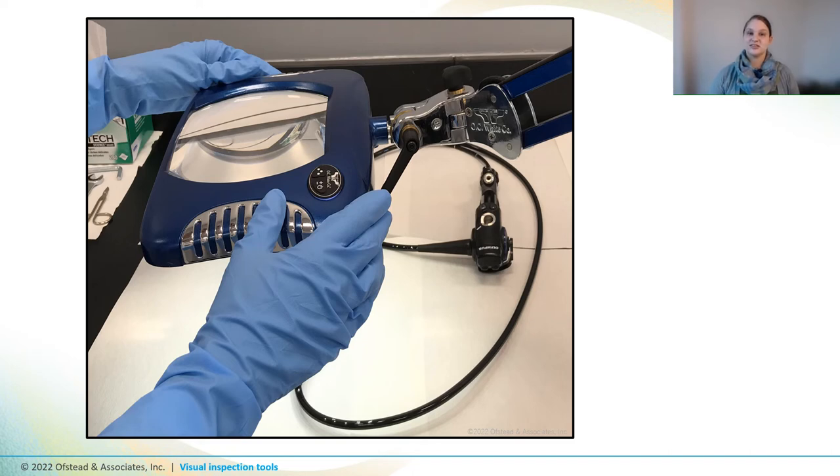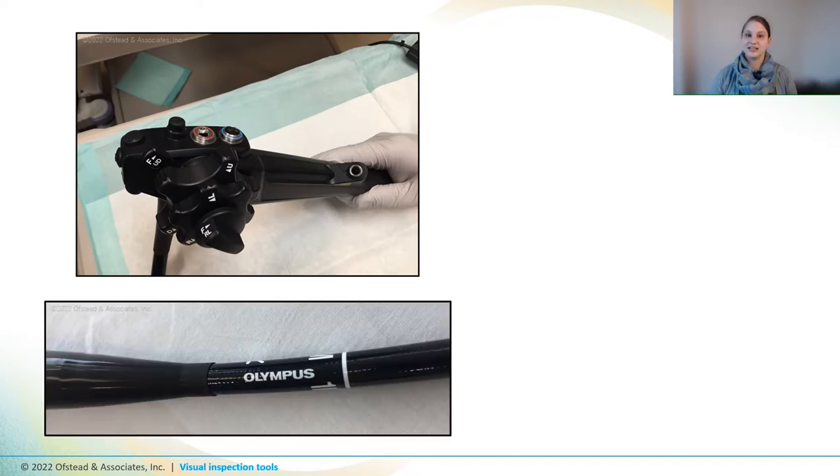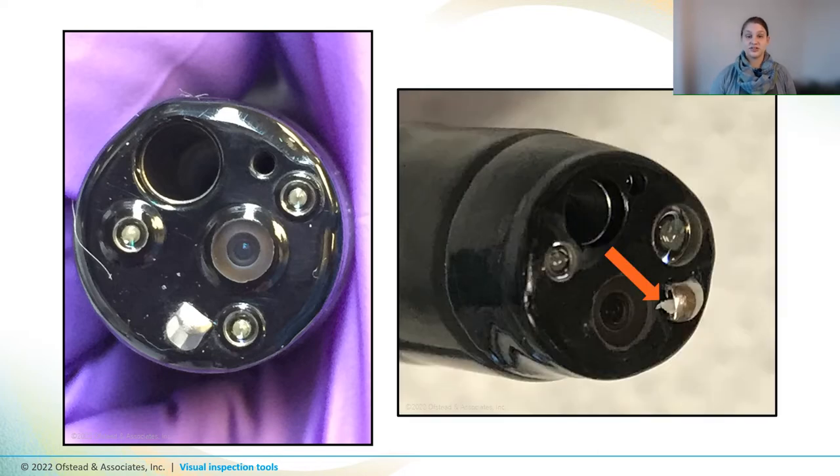When inspecting endoscope exteriors, first arrange the scope so that you can see the components you want to inspect and adjust your magnification system and lighting. Then start at one end of the scope and inspect each component as you move to the other end. Be sure to inspect your scope from various angles by moving the magnifying glass or gently moving the scope around. It's important to follow your institution's protocol for handling any visible defects, which should involve re-cleaning, reassessing, or sending the scope out for repair. Make sure to document your findings and clean off your equipment when done.